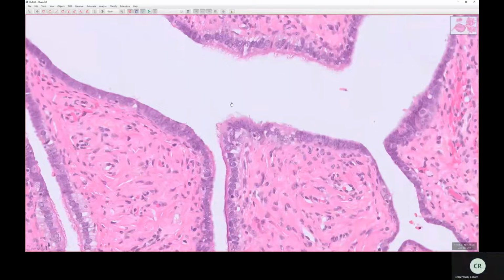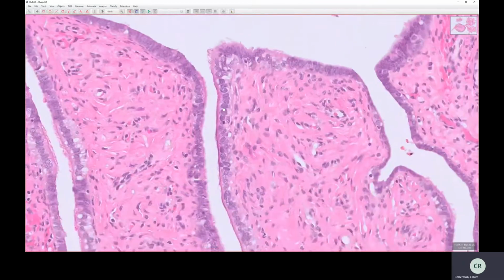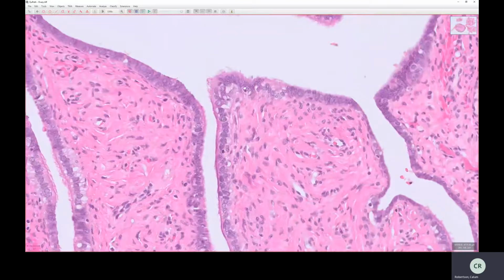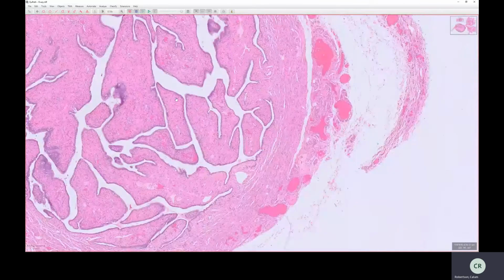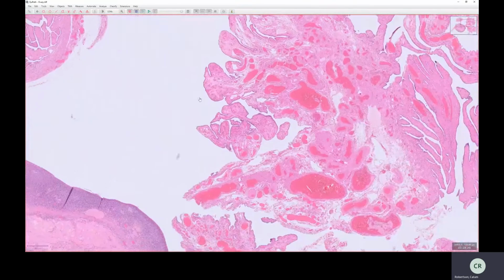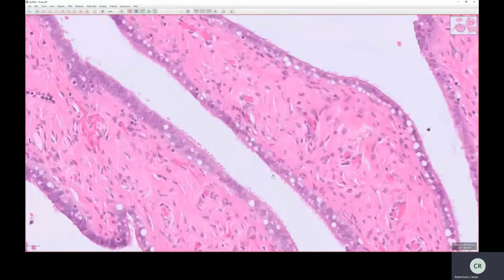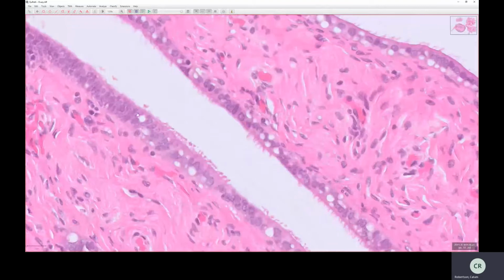And in among these cells, there are also secretory cells that don't have cilia. There are also intercalated cells, which again don't have cilia. It's beyond me to point out which one is an intercalated cell and which one is a secretory cell, but suffice to say, there are three cell types within the epithelium. So that's it, pseudostratified ciliated epithelium, and it's the same epithelium that lines this fimbrial end. If we look in, just to prove it to you, again, they look like they're heaped up, but they're not really. They've got these elongated nuclei with cilia on the surface.